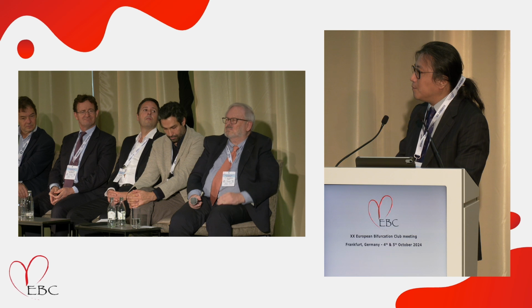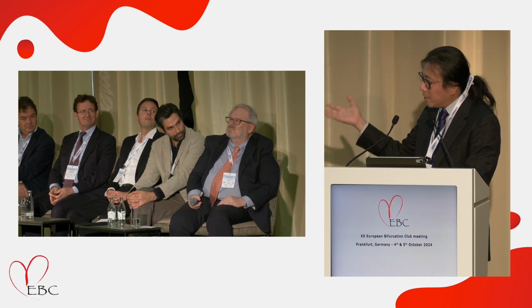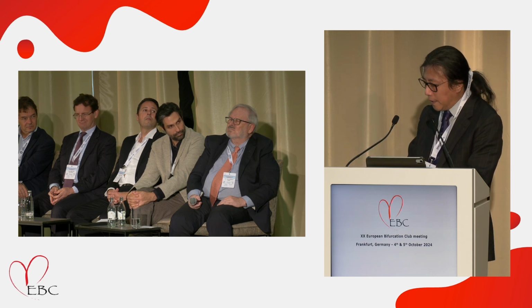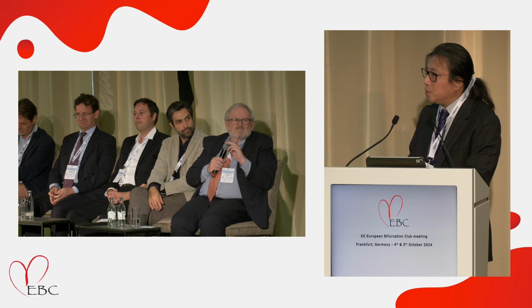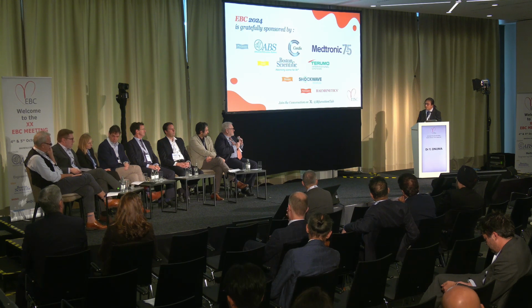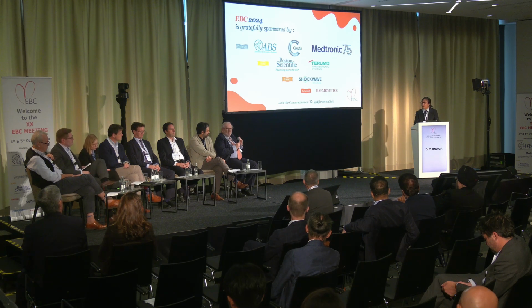So I think it's a little bit more subtle, and it's not about the diagnostic accuracy, but for the planning phase, I think it's important to take into account this difference, and further validation is probably needed for this population. I didn't show it, but we also tested the PPGI and the other parameters in this population, and we have seen that the PPGI is completely different across the three technologies. So I think we really need more data to validate these technologies.